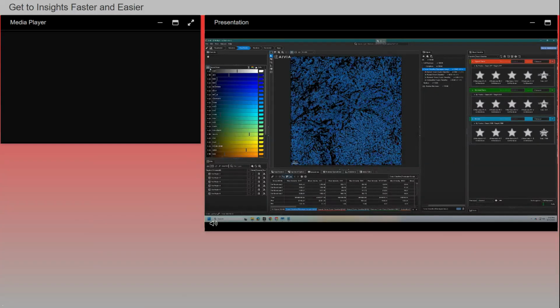I'm going to turn off the channel here, and I'm going to spotlight all the classes. And what we see is a distribution of hypoxic type of tumor cells here in this pancreatic tumor section. And green is reflective of the normoxic tumor that you see here. Normal tissue, as I described earlier, down here, and all the brown that are unclassified. And this is where interesting discoveries can happen.